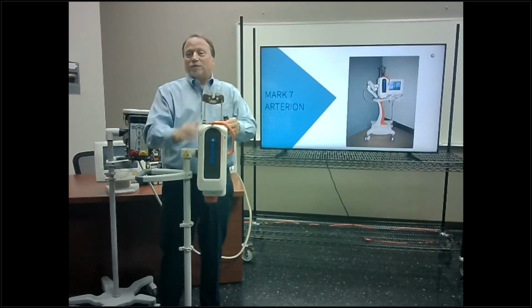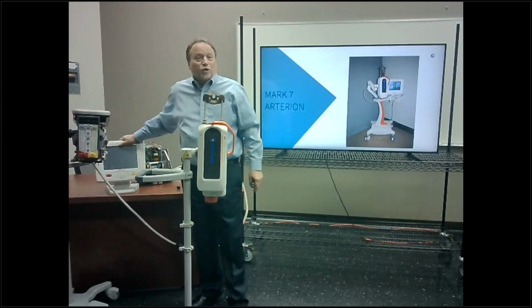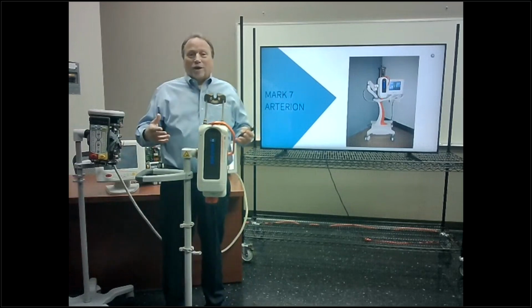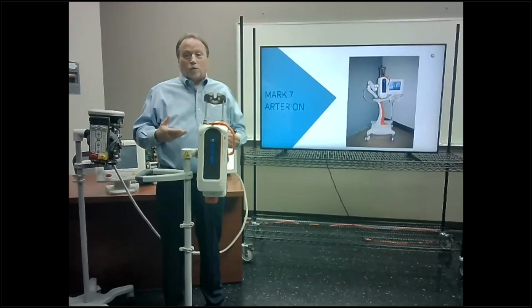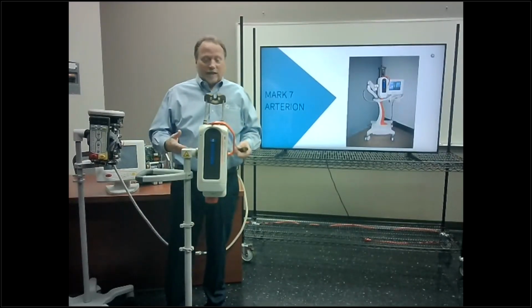Display is the old type of Stellant display. That works very well, so they put it on here. The power module, they did a fantastic job. There's only 3 boards in the power module and a power supply. They did a fantastic job.